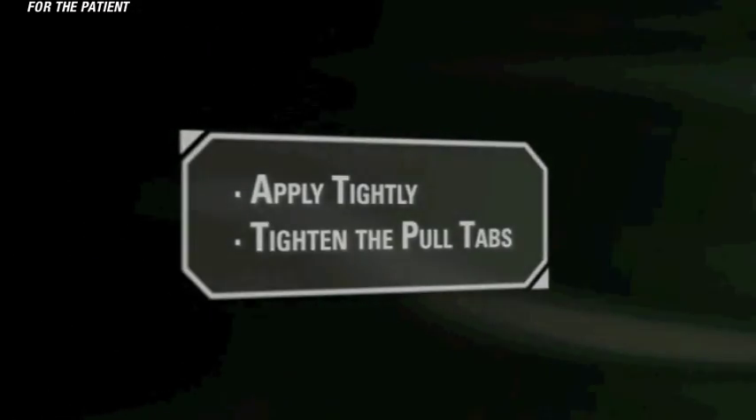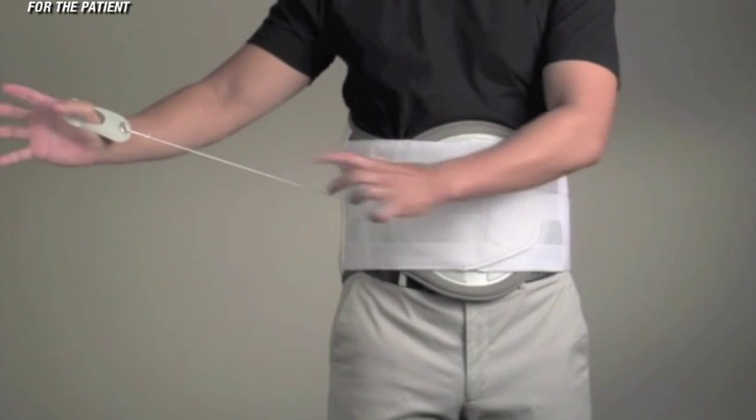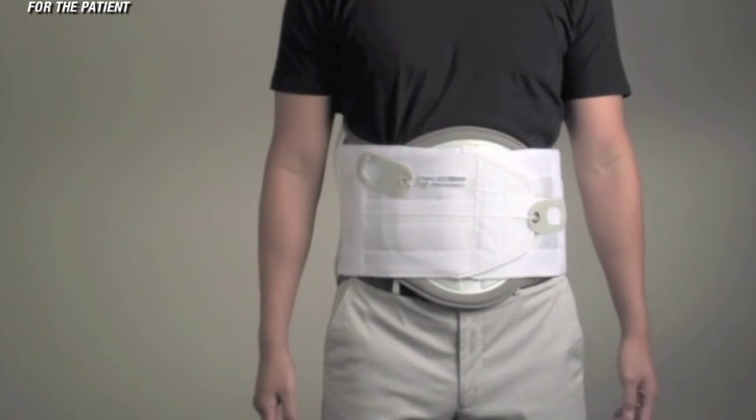Tighten the pull tabs. When the Quickdraw is fit as closely as possible, pull the pull tabs away from the brace until the desired compression is achieved, and touch down the pull tabs onto the Velcro on the outside of the Quickdraw.